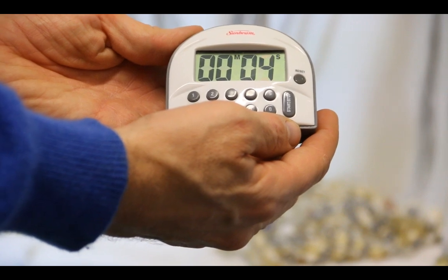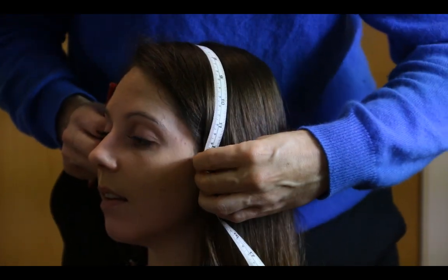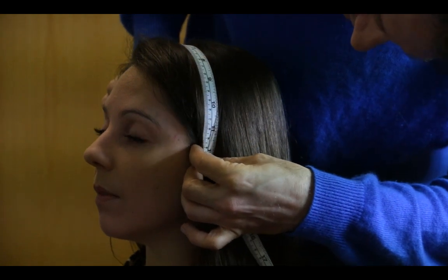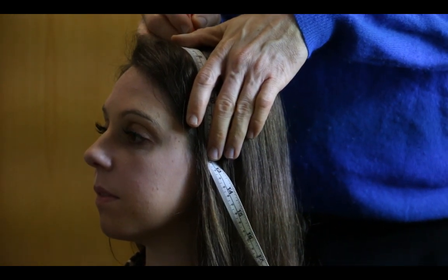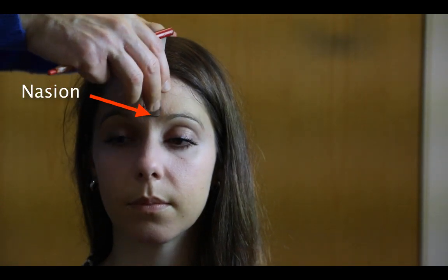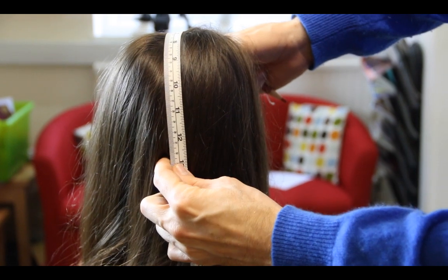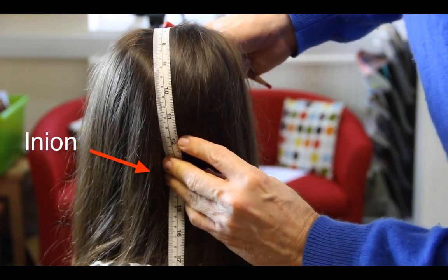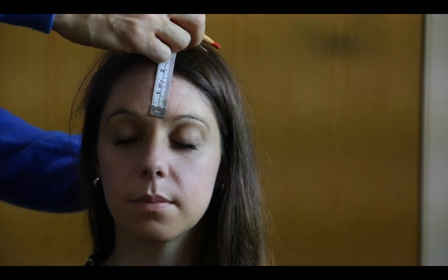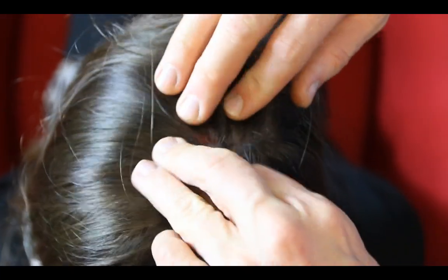Next, take measurements to find the exact center of the participant's head. First, measure from jawline to jawline — you may need to ask the participant to open and close their mouth to feel where the top of the jaw is. Once you've found the exact center, make a mark with the crayon. Then measure from the nasion — the point right between the participant's eyebrows — to the inion, which is the bony projection of the skull at the back. Divide by two to find the center and make another mark. The two marks should form an X at the exact center of the participant's head.